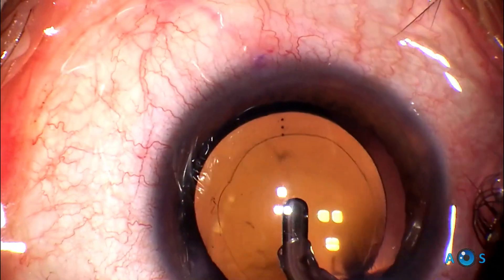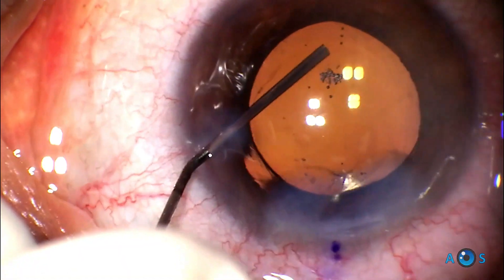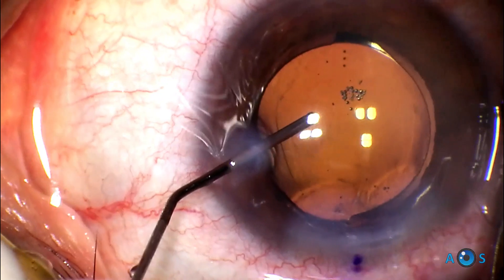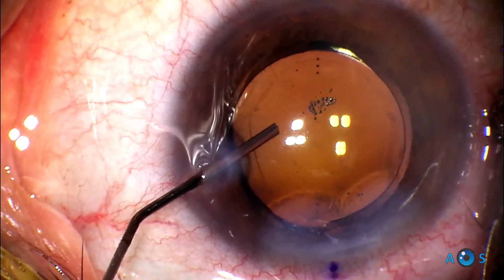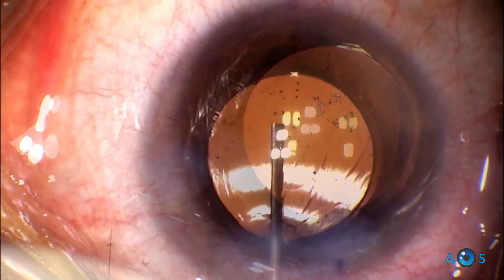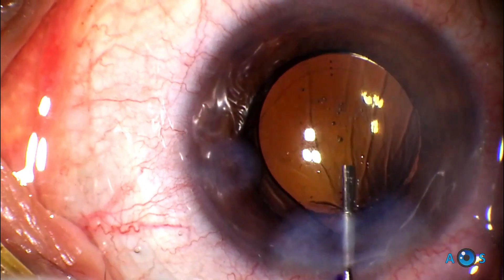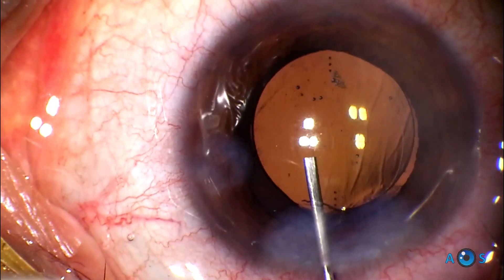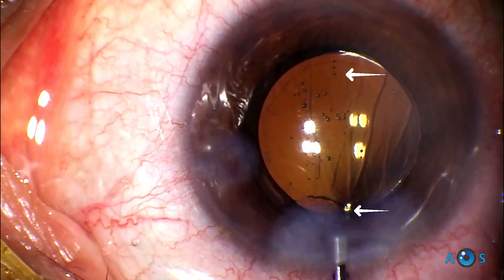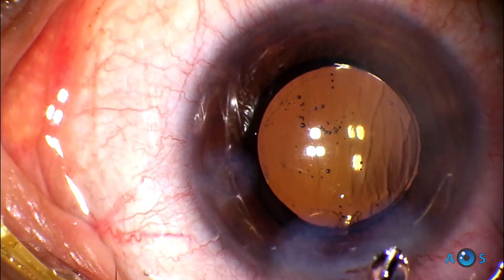The Vivity is also available for toric corrections as shown in this video. We find it easier to rotate in a clockwise orientation, so one useful tip is to leave it near the intended axis and then fine-tune the final position after hydrating the corneal incisions using the BSS cannula. The results have been very good, with most patients obtaining comfortable spectacle-free vision, aiming for minimum myopia in the non-dominant eye.